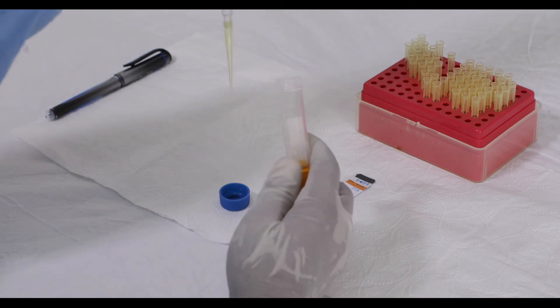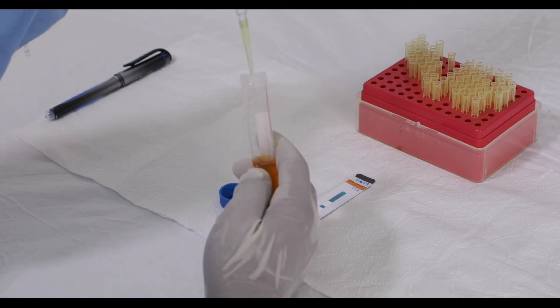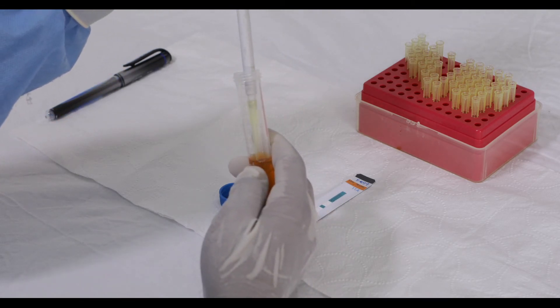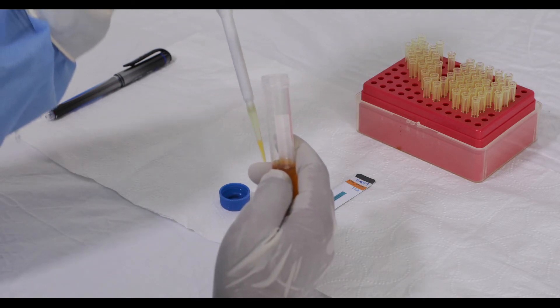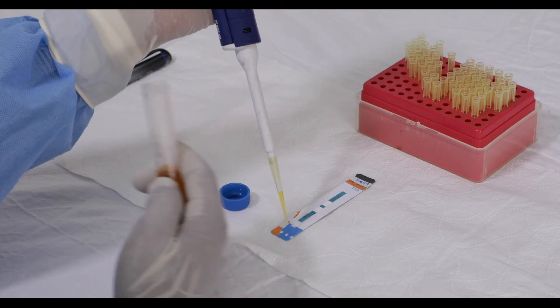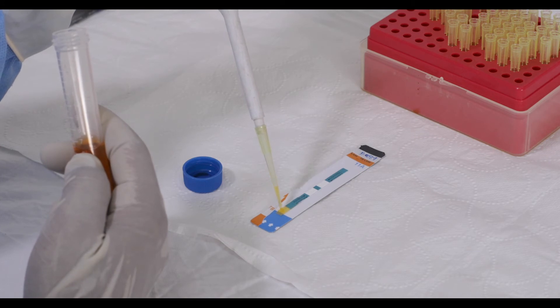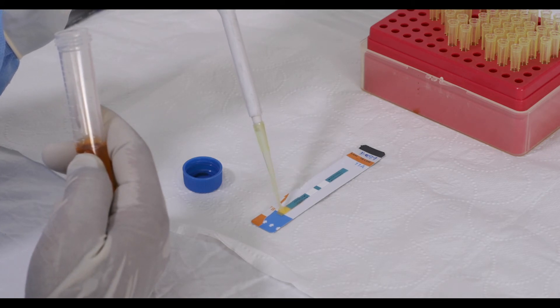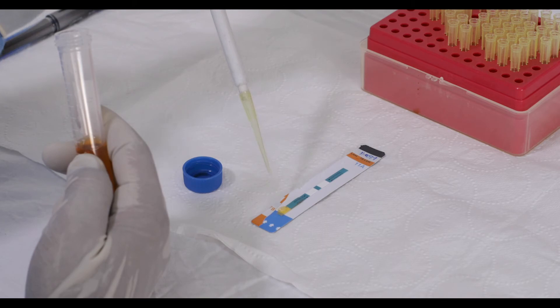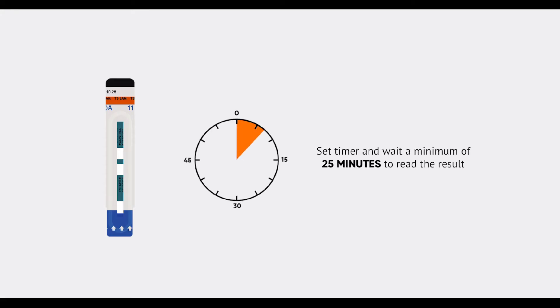Using the already calibrated pipette, apply 60 microliters of the sample — or 2 drops of urine — to the sample pad, a white pad marked by the arrow symbol. After that, set a timer and wait a minimum of 25 minutes to read the result.